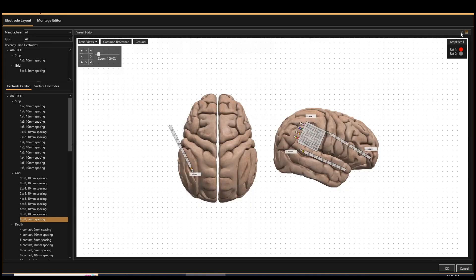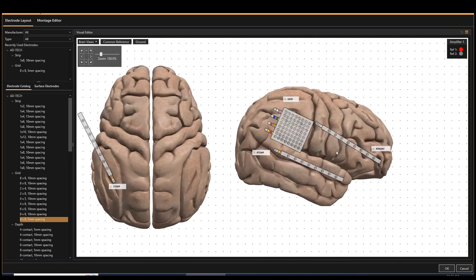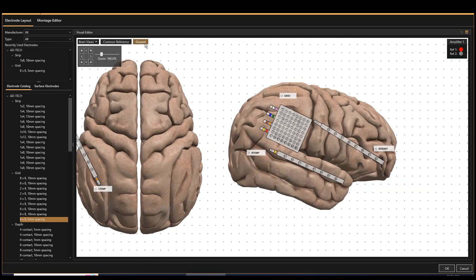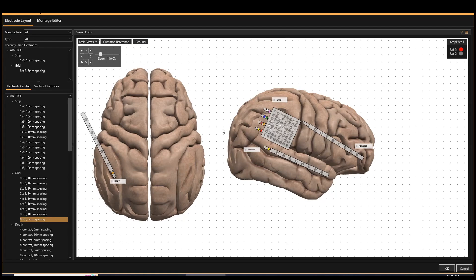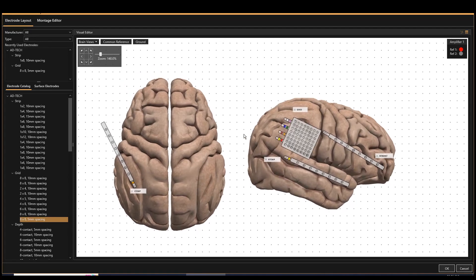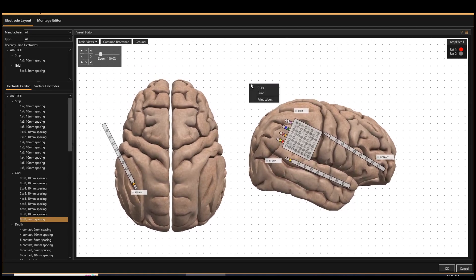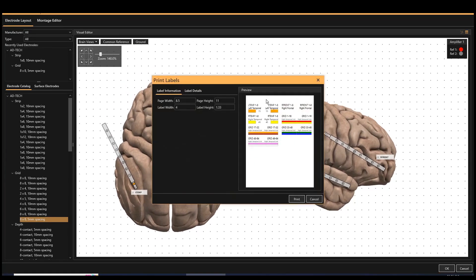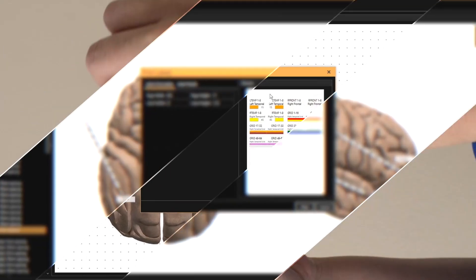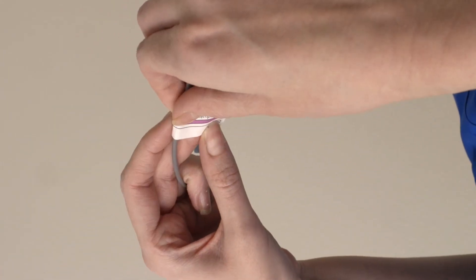At any time during a case, reassign ground or reference to any contact on any amplifier from the software without the need to manually relocate any electrodes. You can also print labels for electrode connector cables.